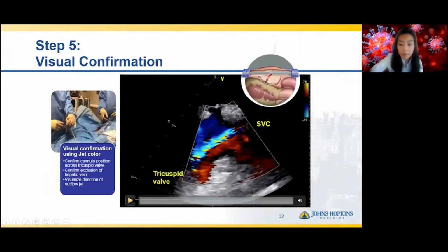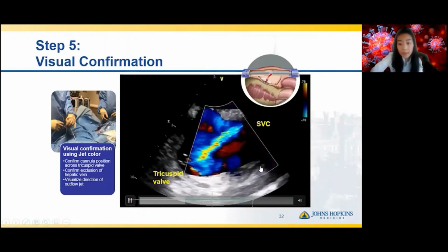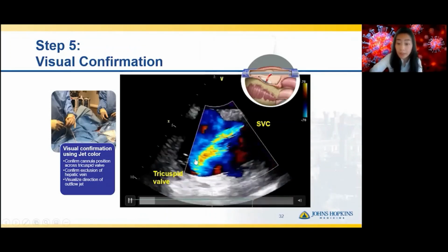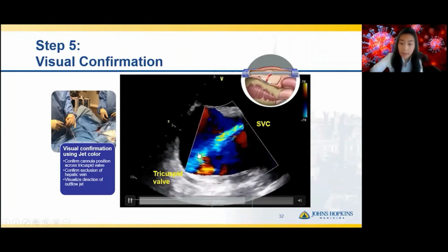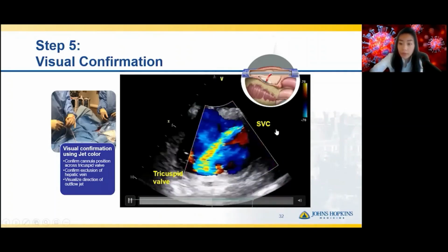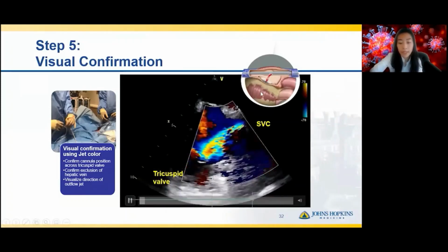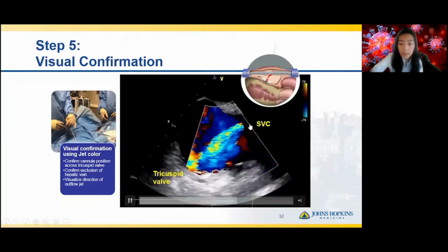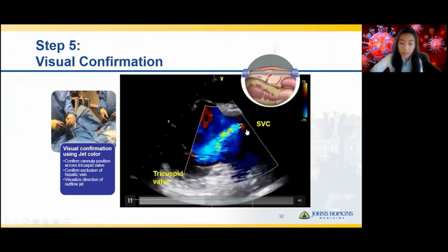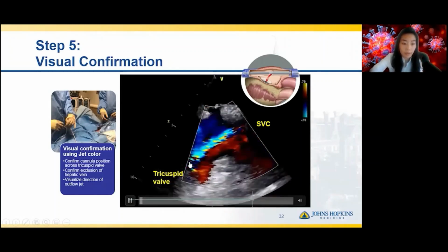Finally, the exciting moment of truth. We have our cannula position and we begin ECMO flows. When we put on color flow Doppler, which is a tool in echo used to assess the velocity of blood flow, we see this very linear, bright jet of yellow and bluish flow that corresponds with high velocity, and the outflow from the outflow cannula of the catheter. This is an ideal position because we can see it originates high in the right atrium, toward the SVC, and is directed right above and through the tricuspid valve.